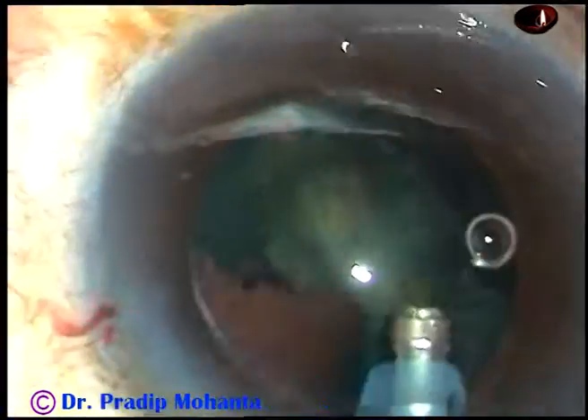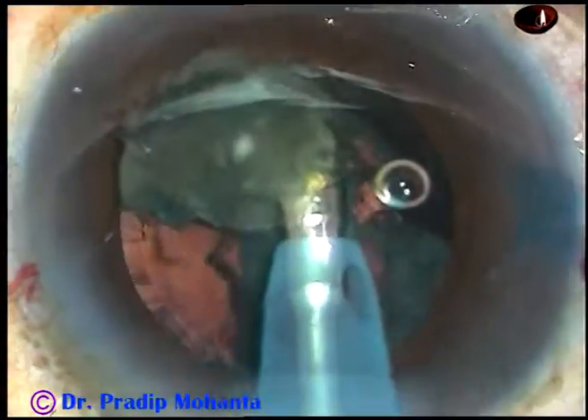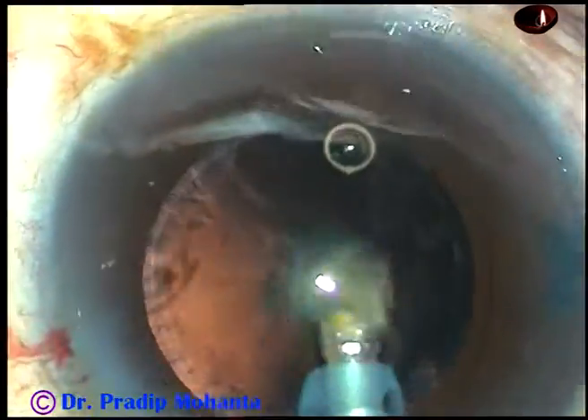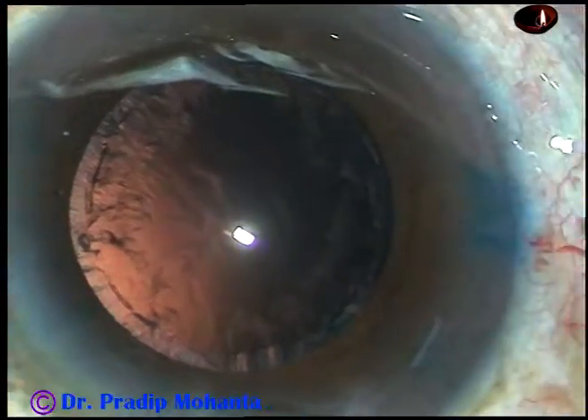Now this is the other hemi-nucleus. Just tilt it and start emulsifying it. Phaco power used in this case is 40%, flow rate is 35 ml per minute, and vacuum is 350 mmHg.